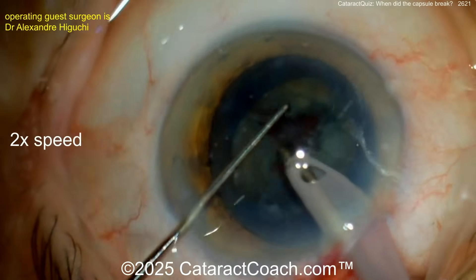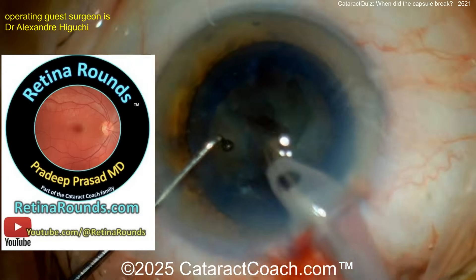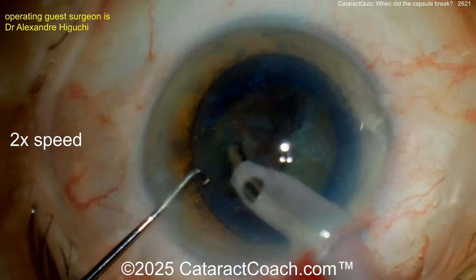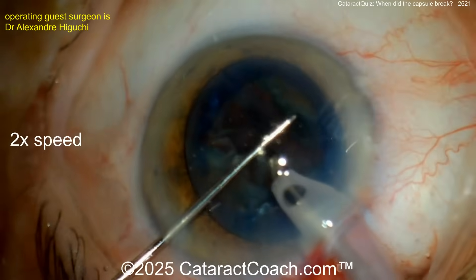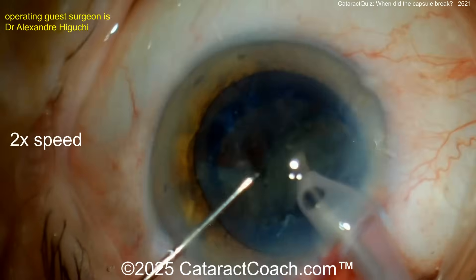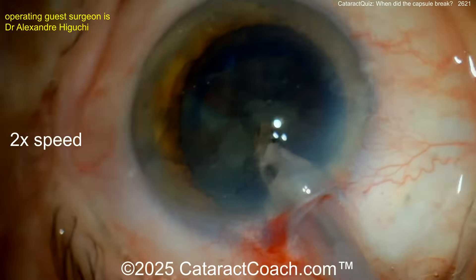Certainly a very experienced and skilled surgeon. Now back to our case — removing the nuclear pieces slowly. Everything looks good. Nice technique, good draping, irrigation — everything was pretty reasonable. Watch out, let's see if anything is going on.